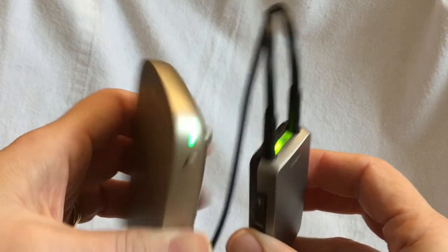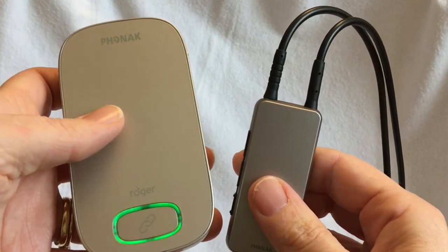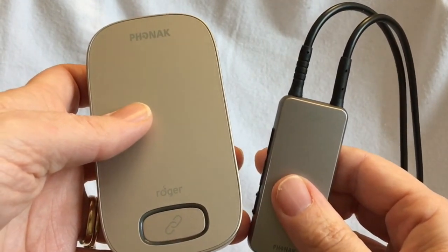If you want to connect your Roger Focus, MyLink, or hearing aid directly to the Multimedia Hub, just press the Connect button on the front within 4 inches or 10 centimeters next to the device.